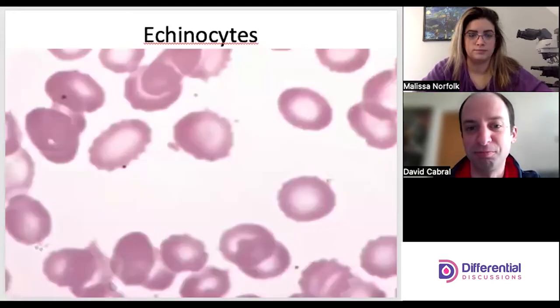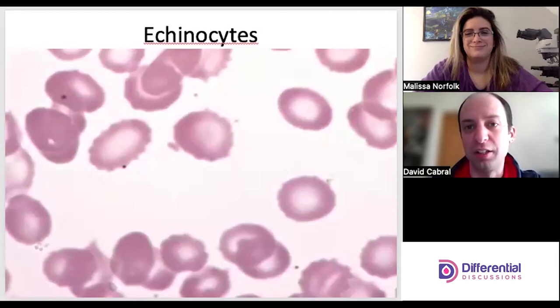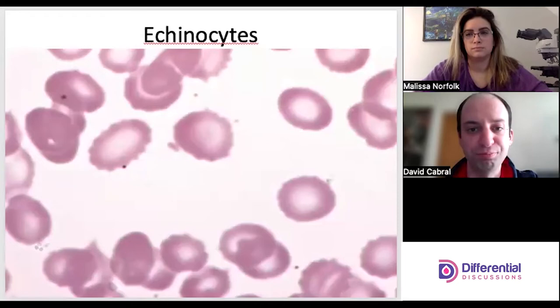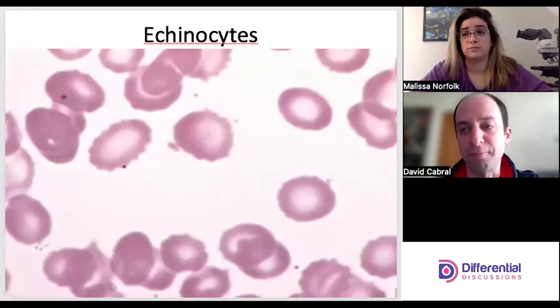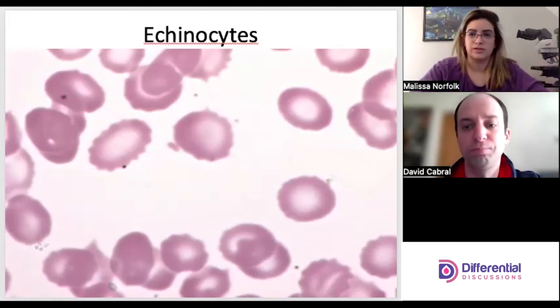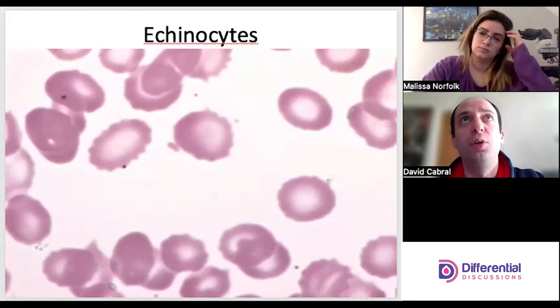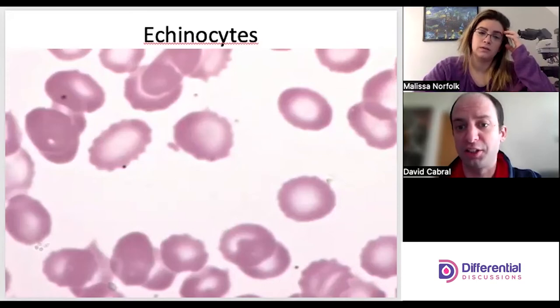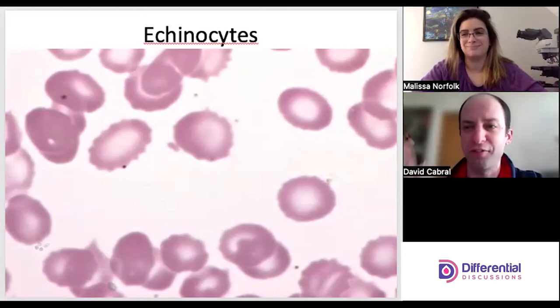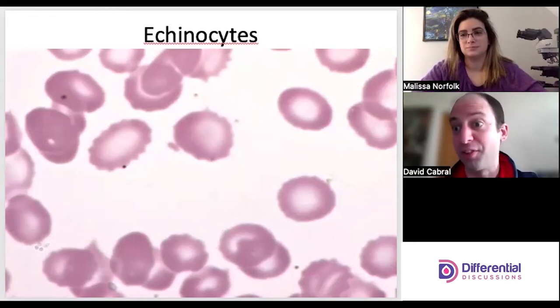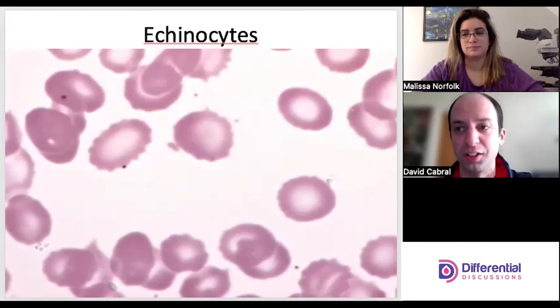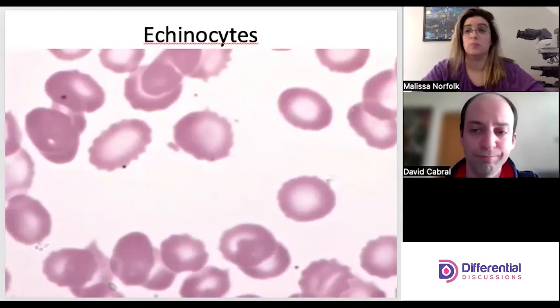Echinocytes — I referenced these relative to acanthocytes. Echinocytes have short, even projections across the periphery of the cell, relatively even all the way around, unlike acanthocytes which have uneven projections of varying length and width. Echinocytes can also be artifact on a slide — you might see a bunch in one field and none in another, which is exactly why looking at five to ten fields matters. Echinocytes are sometimes called burr cells.